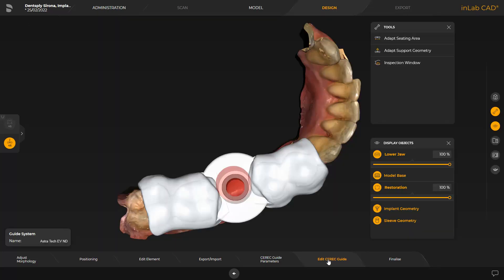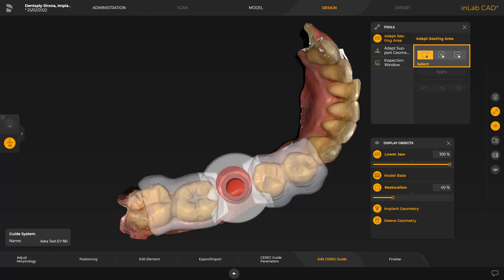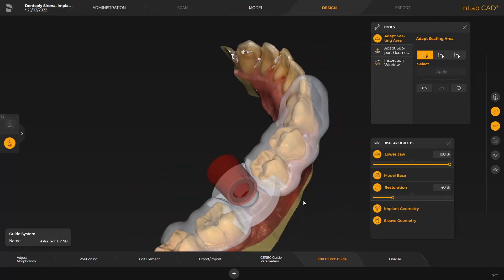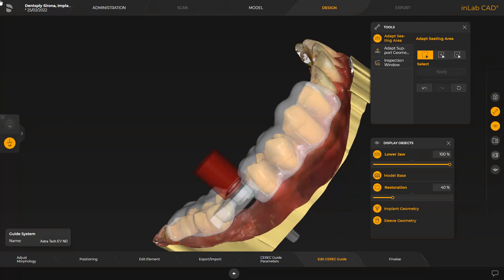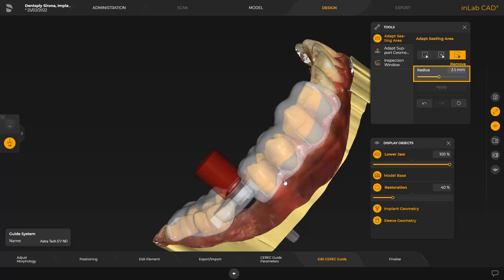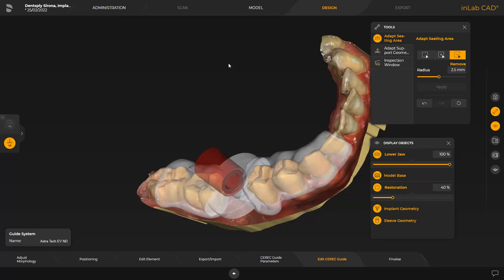The surgical guide sleeve is colored in red, as can be easily seen. Because this is a warning indicating a narrow situation, we will come back to it later in the video. First of all, we enable the Adapt Seating Area tool. Here three options are available. The Select option allows you to mark complete areas and lengthen or shorten the surgical guide seating area. For our demonstration, we extend in the mesial direction. Starting at the surgical guide, we mark the area to be lengthened by holding the left mouse button down. By tapping Apply, the surgical guide is extended. We switch to the last option, Remove. This tool allows you to remove areas in a circular manner. The radius can additionally be adjusted with the slider. For demonstration purposes, we will slightly reduce the surgical guide. By confirming with Apply, the guide was shortened by this area.